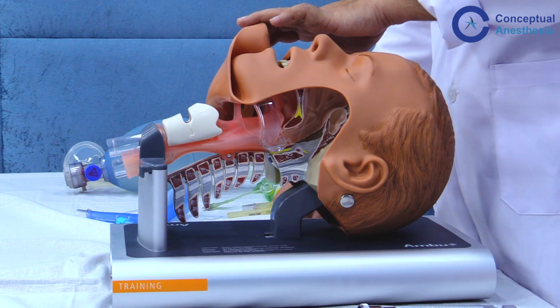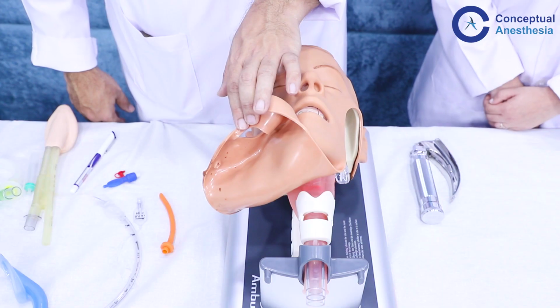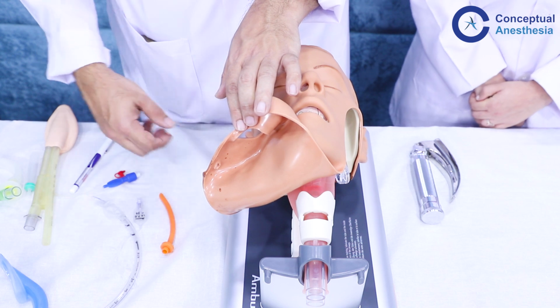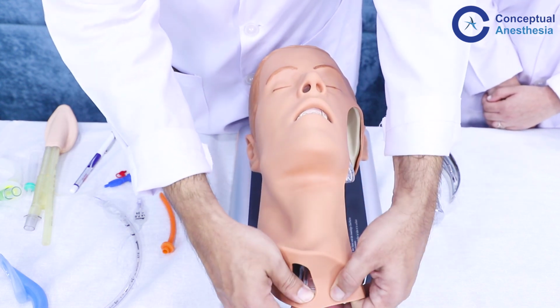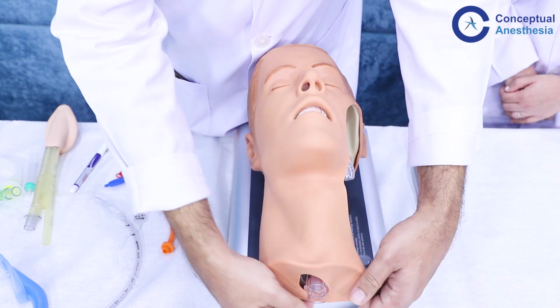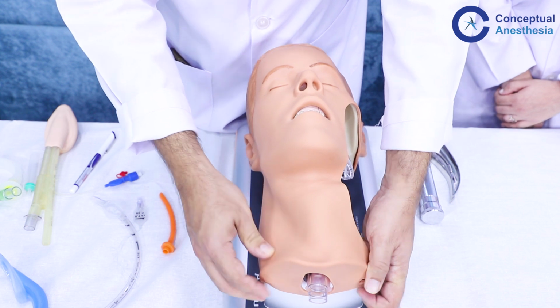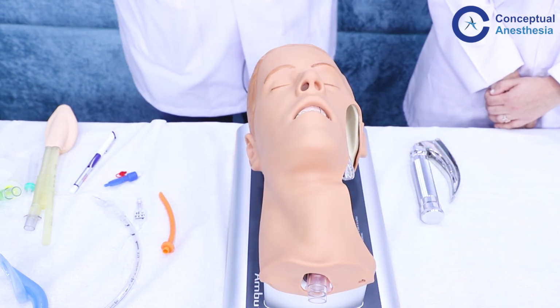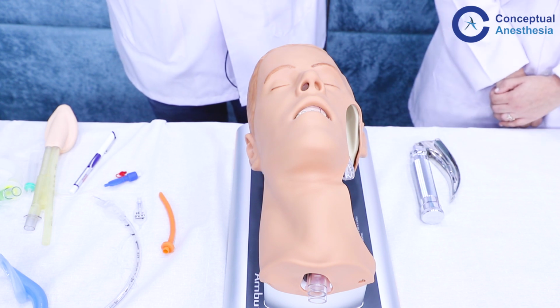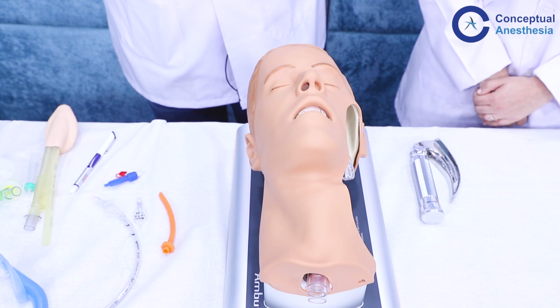So we take either the cricothyroidotomy set, or if you don't have that, we take a wide bore IV cannula which is 14 gauge, and then we introduce it into the cricothyroid membrane, and then we can ventilate through it using a high frequency jet ventilation. Remember, this is just a temporary airway, it can get displaced, so you need to call the surgeon and have a permanent access in the form of tracheostomy once your patient is stable.